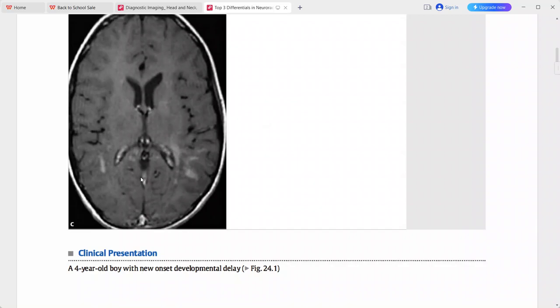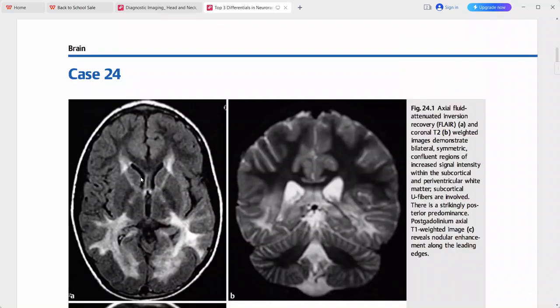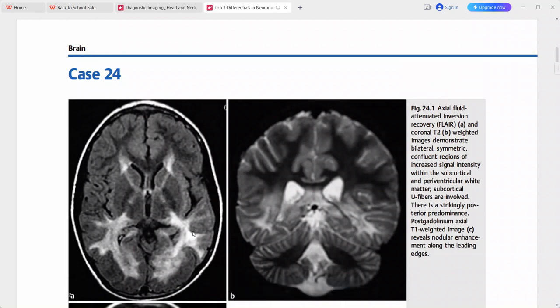Differentials for adrenoleukodystrophy include ADEM, other dysmyelinating diseases, multiple sclerosis, and atypical infections. However, this imaging picture is quite typical for adrenoleukodystrophy.